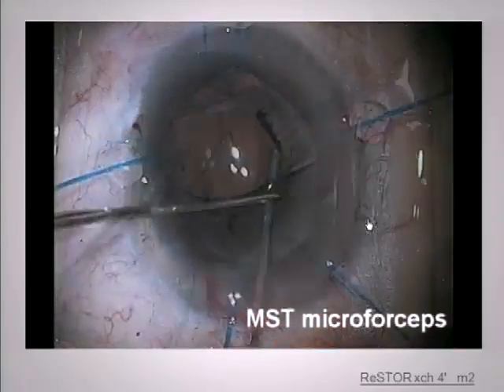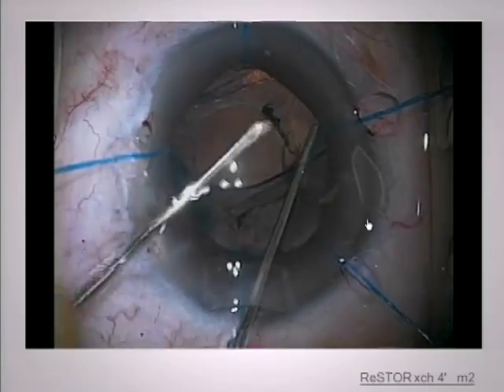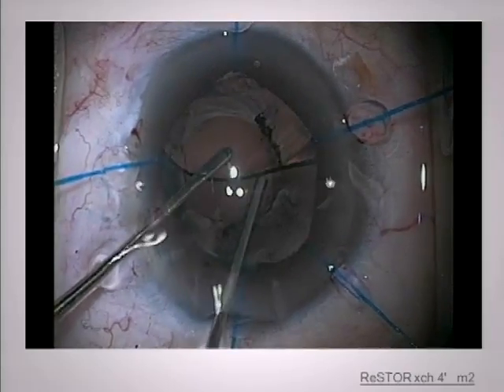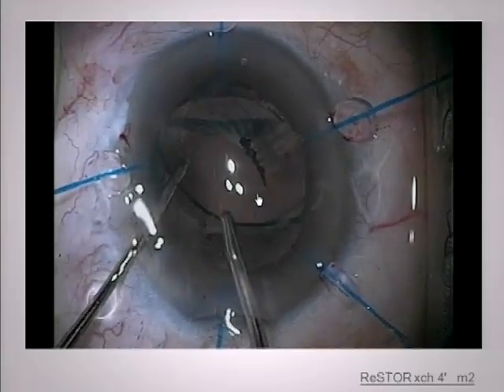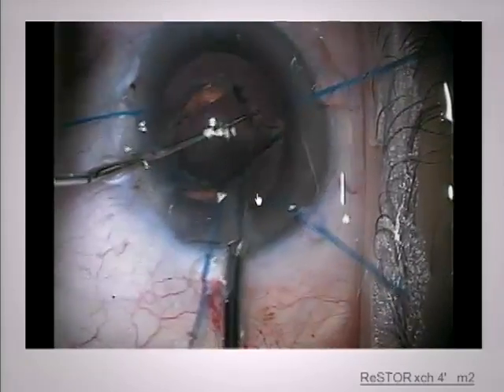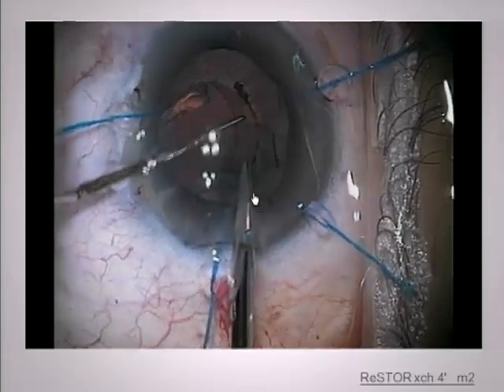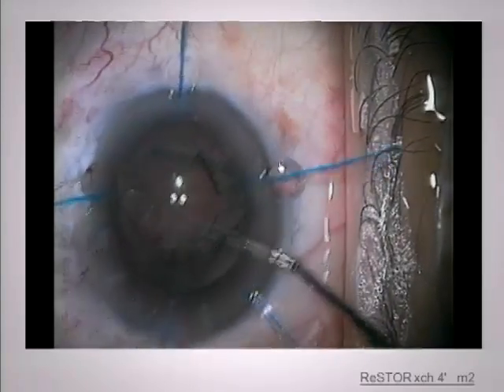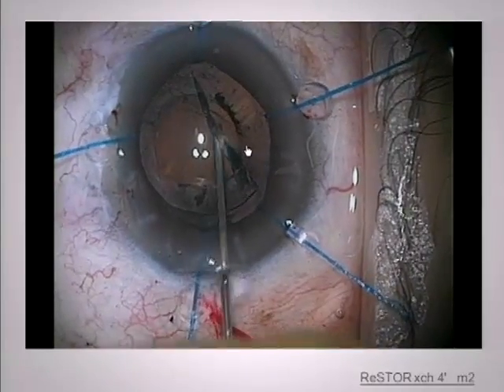I'm able to pull out one half, and the other half is mobilized. Plenty of viscoelastic because the posterior capsule is gone at this point. I'm trying to obviously maintain the intact capsulorexis because that's pretty much all I'm going to have for IOL support. Here I'm using this micrograsper — it's a large enough piece that I have to pull it over, and that's the last haptic that I transected to free it up. Both tips of the haptic were fibrosed in; they're both left behind, but now I've mobilized this piece.